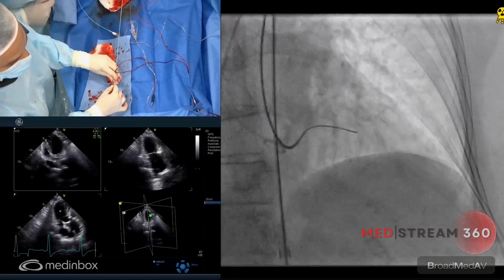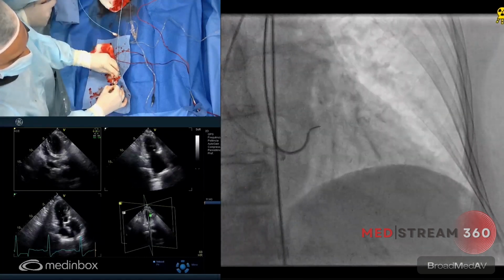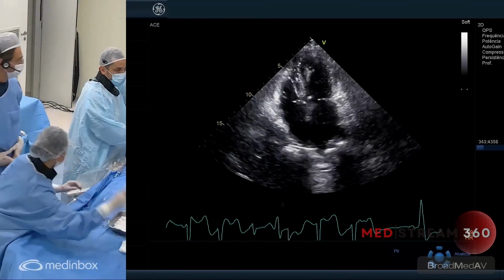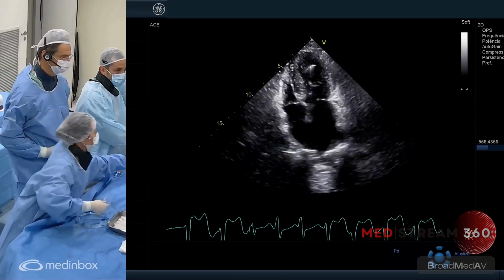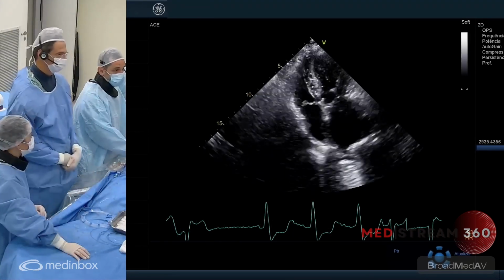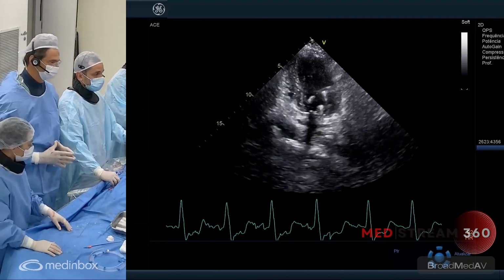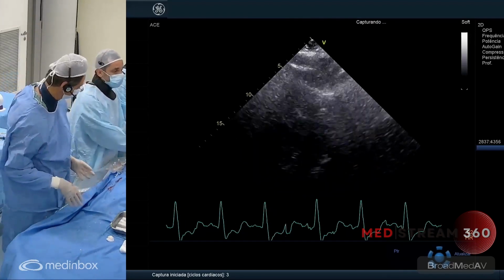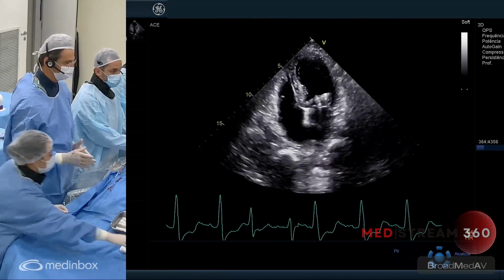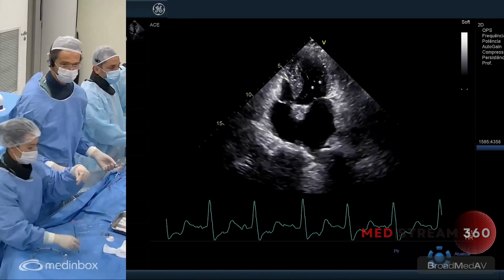So now we are trying to position the guide wire in the apex of the left ventricle. Not recross again. Okay. Now is it in the apex? Better now. Let me see that. It's in the apex, Tito? Yes. Now it's almost there. Sounds good. Oh, it moved. Move it to the base now. Lateral wall, still in lateral wall. So we are going to change again. This is a hard part of the procedure, as Dimitri said. Because of the eccentricity of the valve, we could not drive the guide wire to the place where you want. Now we are bringing back the soft wire again.